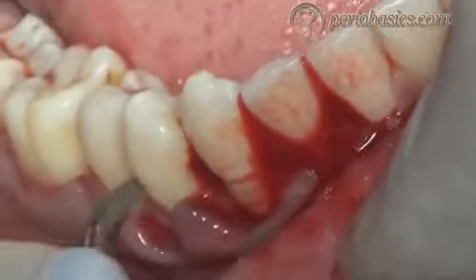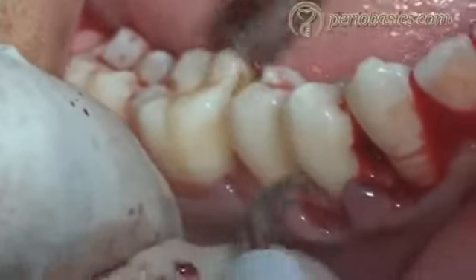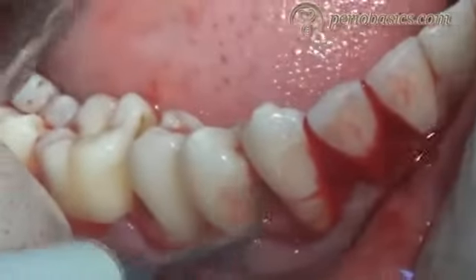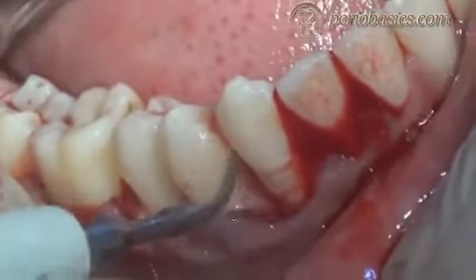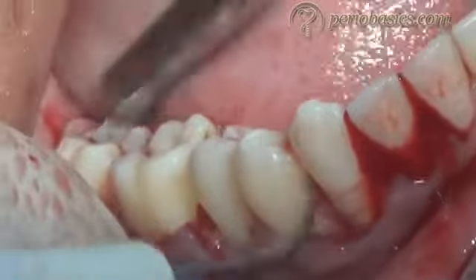And then we start with the scaling of the teeth. As the root surfaces are clearly accessible to us, we do the scaling. You can see the calculus particles coming out. The root surfaces are scaled and they are made absolutely clean.